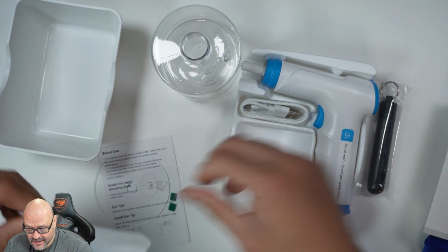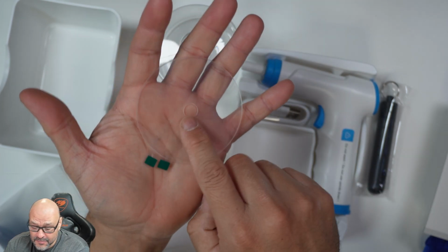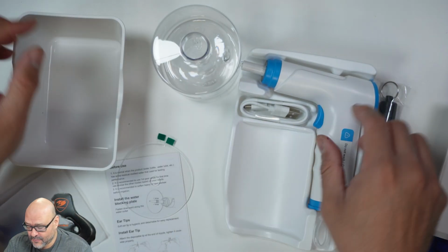I'm gonna put that in here. This is a reflector, where we reflect the actual water or anything coming out of your ear back. When you're doing this, it's going to be in the tilt mode. I'm going to show you guys how in a way.